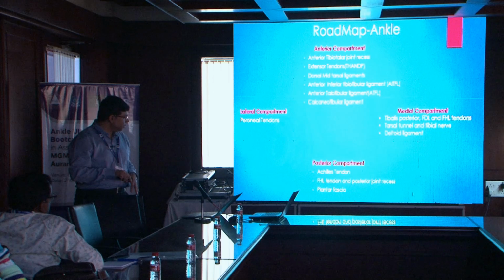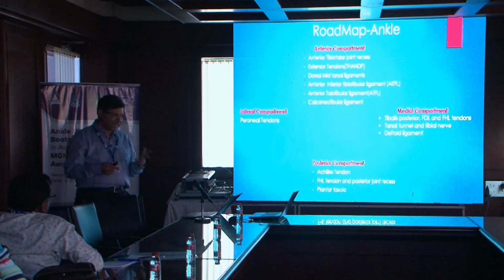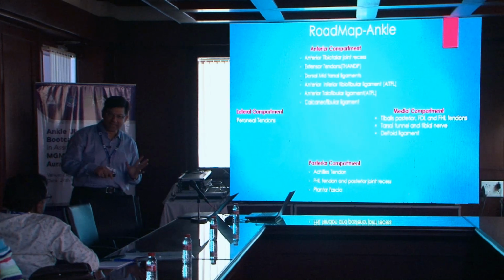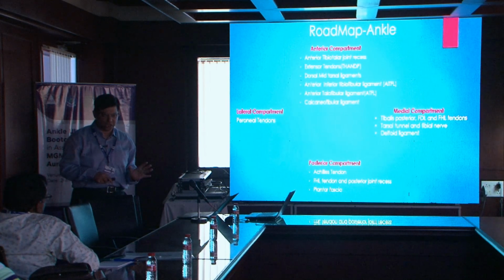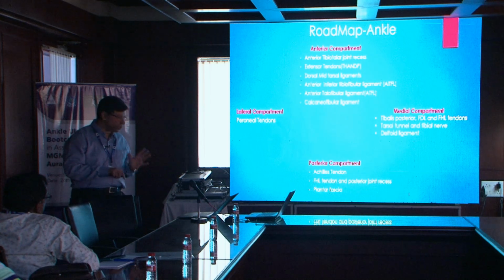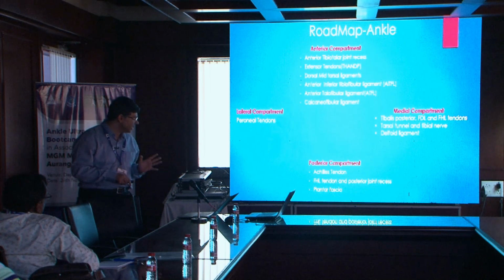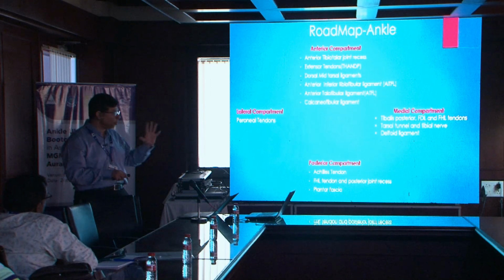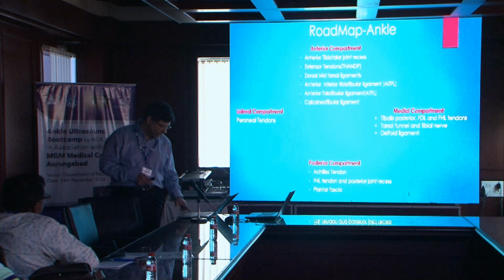Then you come to the posterior compartment where you evaluate the Achilles tendon. The flexor hallucis longus tendon can also be evaluated from the posterior approach, and we'll show you when we do the demo. You can look at the posterior tibiotalar joint recess for effusions, synovitis, and the plantar fascia. So that's how we will look at each compartment and its structures, one by one.